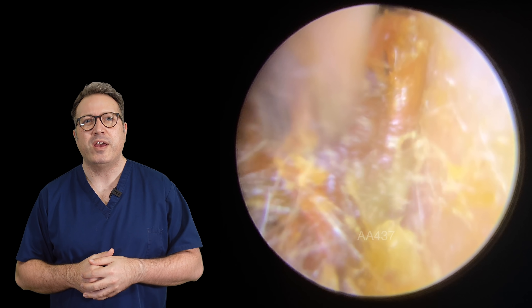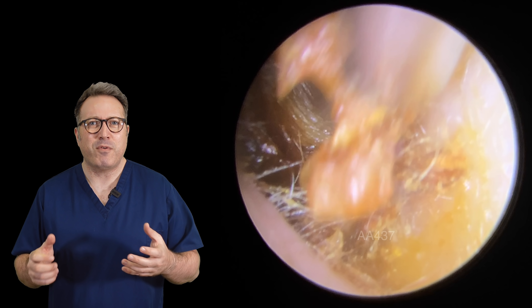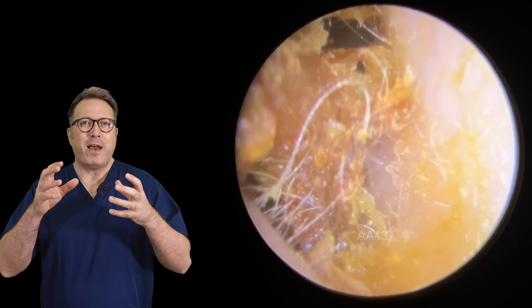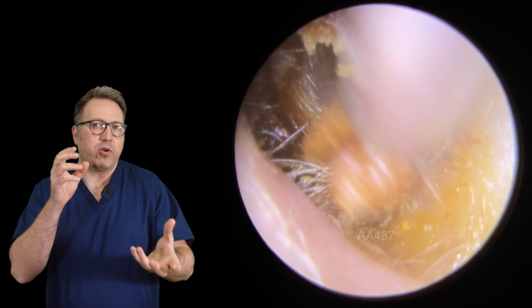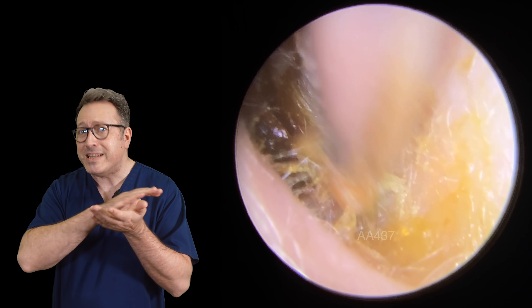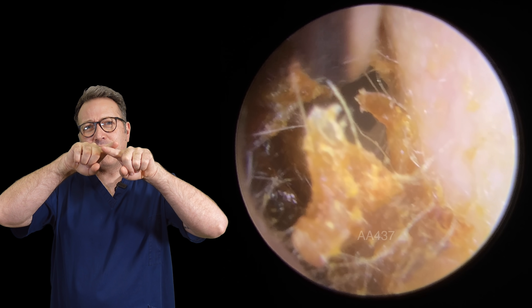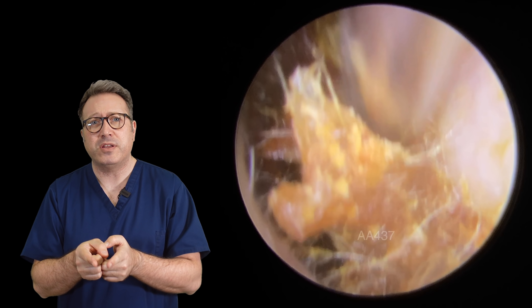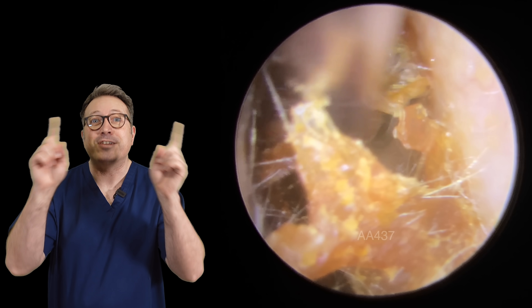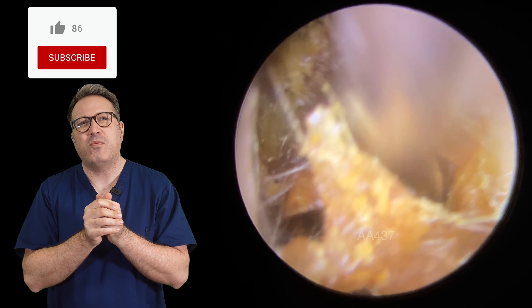Hopefully trying to hold onto it and get a much larger piece coming away. With this particular type of wax and dry skin issue, you tend to find they go hand in hand. If you've got some dry skin, the chances are the wax trying to pass over the top of that is going to dry out a little bit. It's formed this kind of ring around the outside edge of the ear canal — a ring of dry skin and dried out wax.